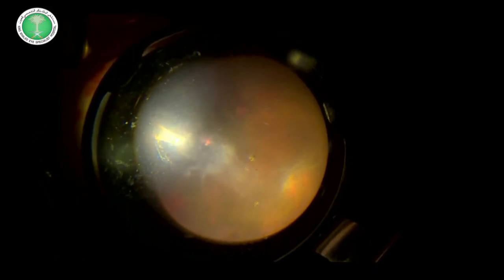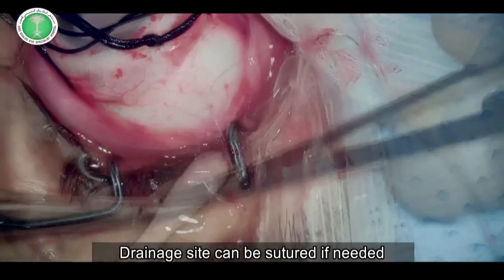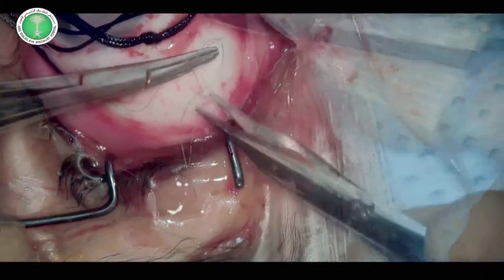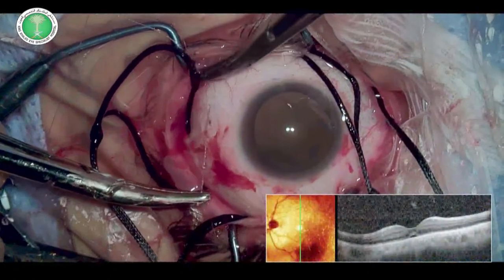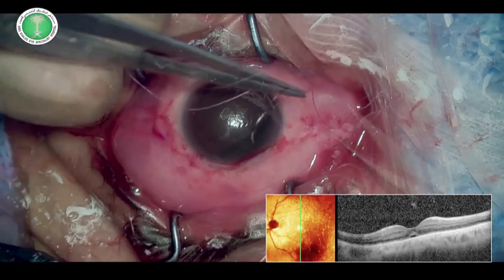The site of the chandelier light and the site of drainage can be sutured if needed. The scleral buckle procedure is then completed as usual, resulting in a flat retina on the first postoperative day.